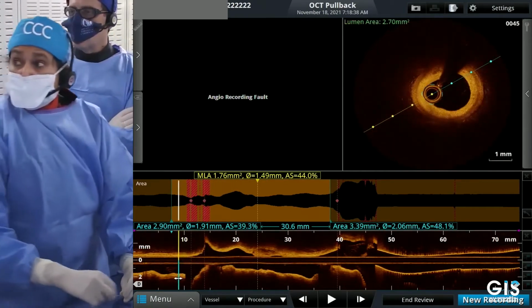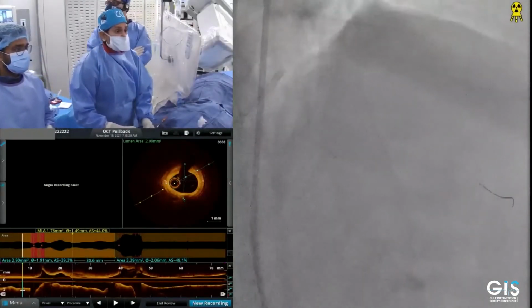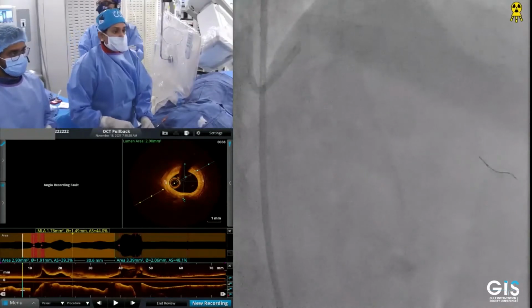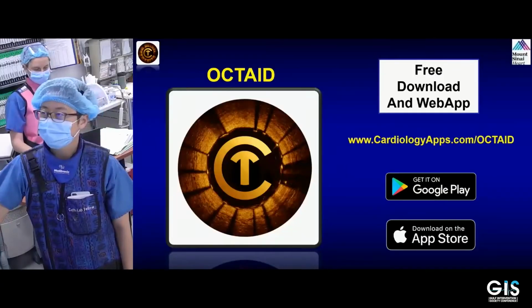You want to go to the slides? Yeah, they can show the OCT. Let's show the OCT slide, please, and a few slides related to this. Go to the slide set. Okay.